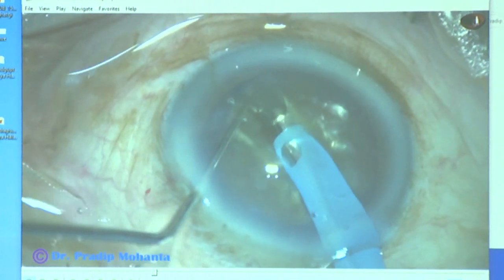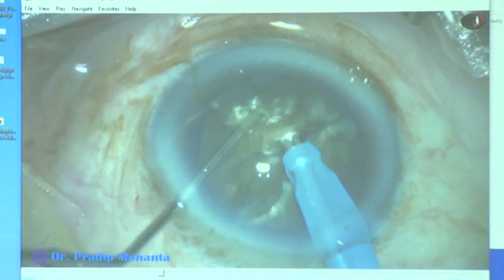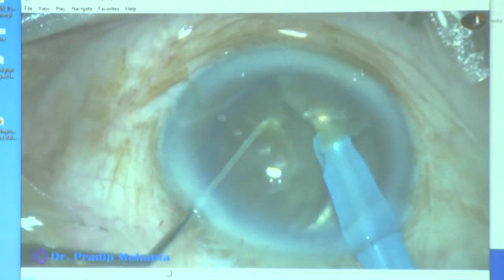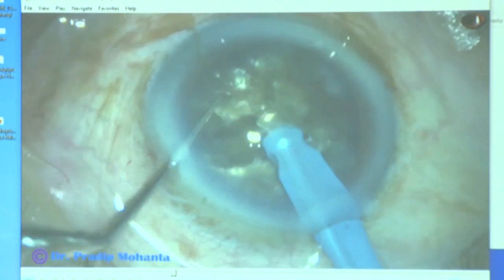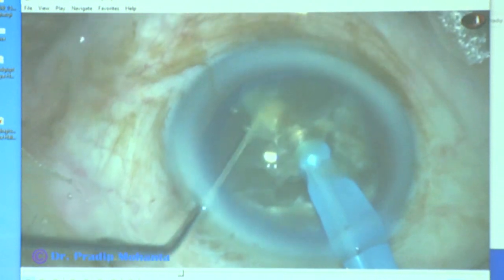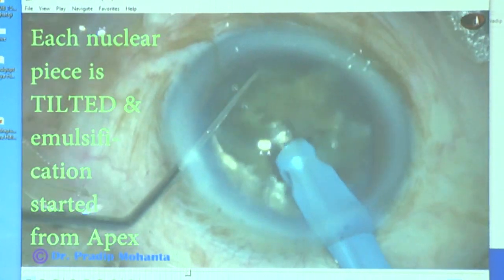And on the other side, I go to a deeper plane, hold one heminucleus with vacuum, and divide the nucleus into two heminuclei. In this case, one heminucleus is larger than the other, and I'm dividing this heminucleus into three parts. This is one, come to the bigger piece, and divide this into two parts. And now this is done with very high ultrasonic energy.